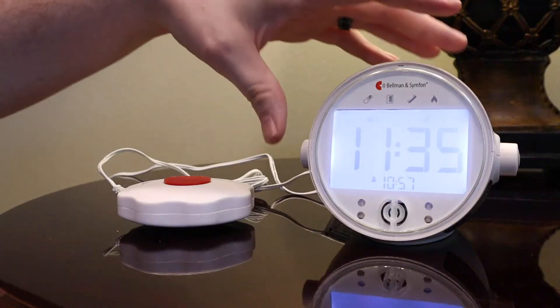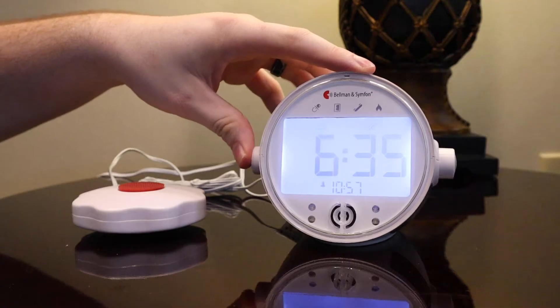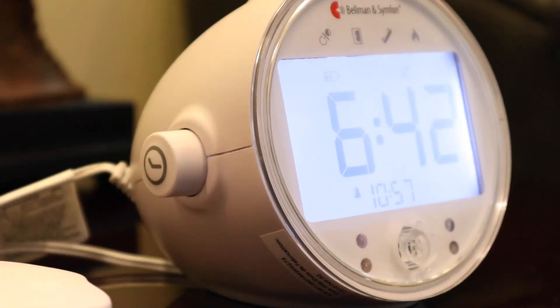To set the time, press in the left dial and turn it to set the hour. To set the minute, press the dial again and then turn it to see the minutes start to change. Pressing the button again will save the time.